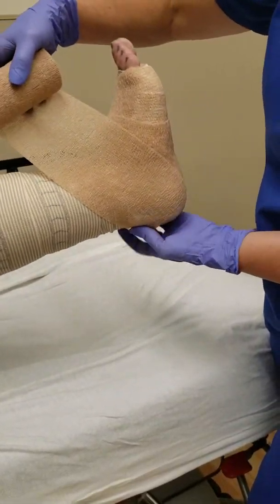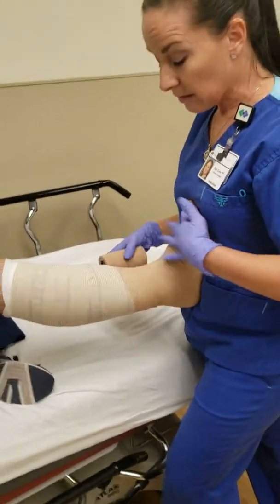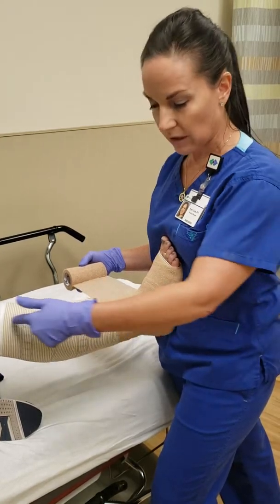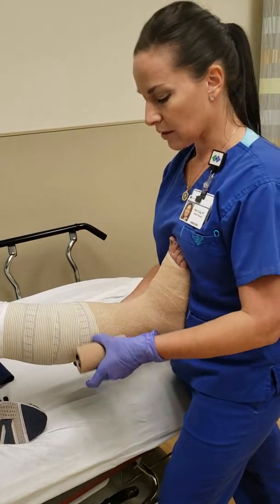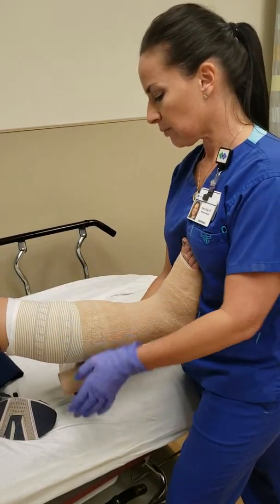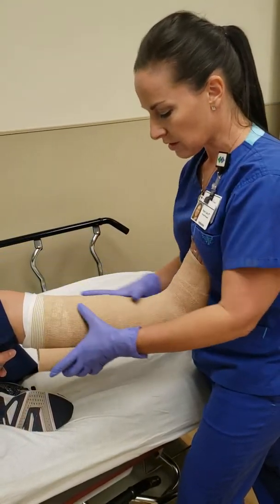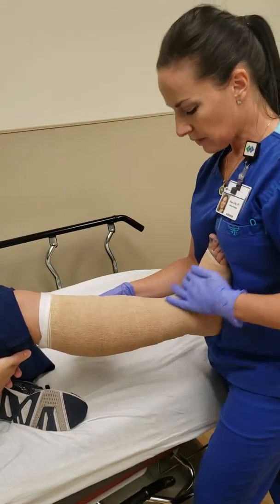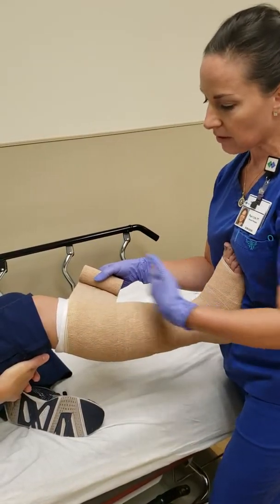I'm going to do my pleat. By the way, this co-band layer is all spiral — whereas the ace layer was spiral on the foot and figure-eight on the leg, the co-band layer here is just a spiral. This helps hold all the layers in place for several days at a time. Initially we like to change the three-layer compression wrap twice a week for initial volume reduction, because the wraps will start to slide and bunch. If things really settle down, we can go to once a week. I'm going to wrap all these layers in; I have extra because her leg isn't very big or long.